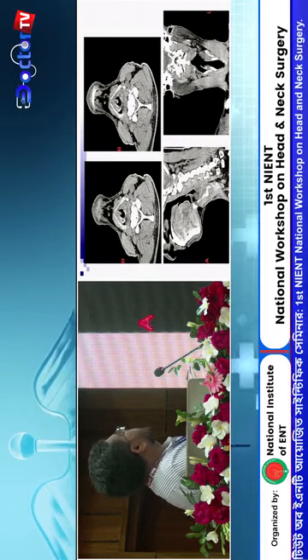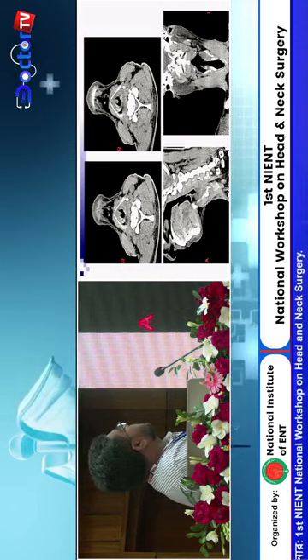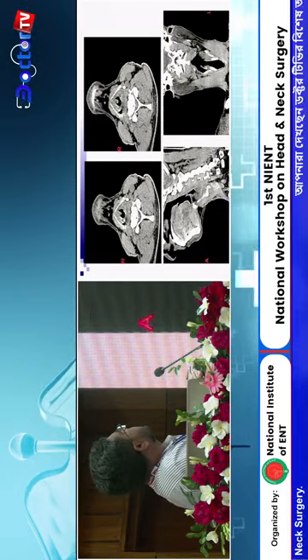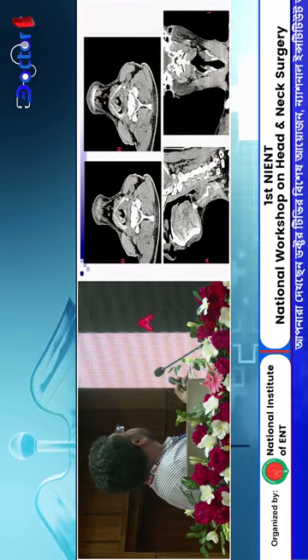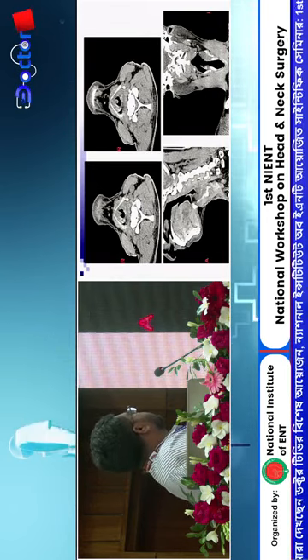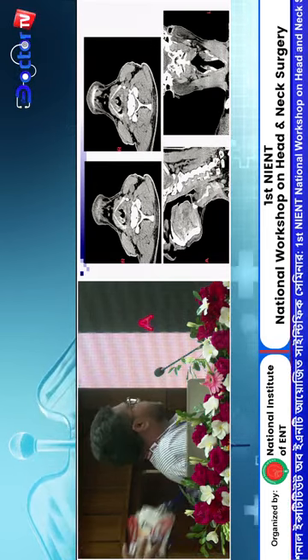There is a tumor of upper stage of supraglottic tumor. We see both the right and left sides of the supraglottic tumor. There is extension into the anterior part. The same here is the piriform fossa. This is the upper limit, in the upper part, and this is a little bit lower part of the lesion. And in sagittal, we see a large lesion in the supraglottic area. We see on the left side a large lesion in the supraglottic area.